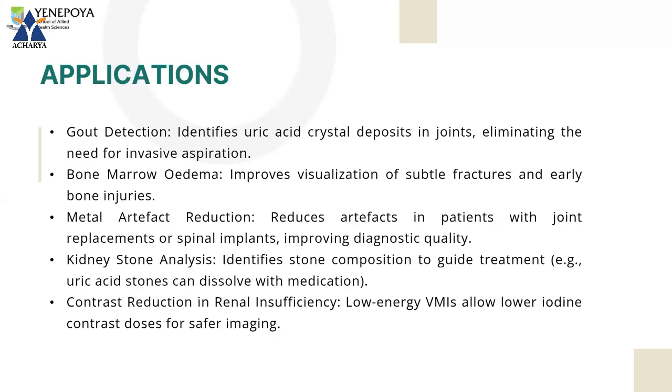Okay, these are the applications. There are multiple applications, and you can differentiate these applications in terms of cardiovascular imaging or renal imaging. You can differentiate them in different ways, right? In terms of radiation dose reduction or reduction in the contrast agents. You can divide it amongst several categories, and you can put in a lot of applications.